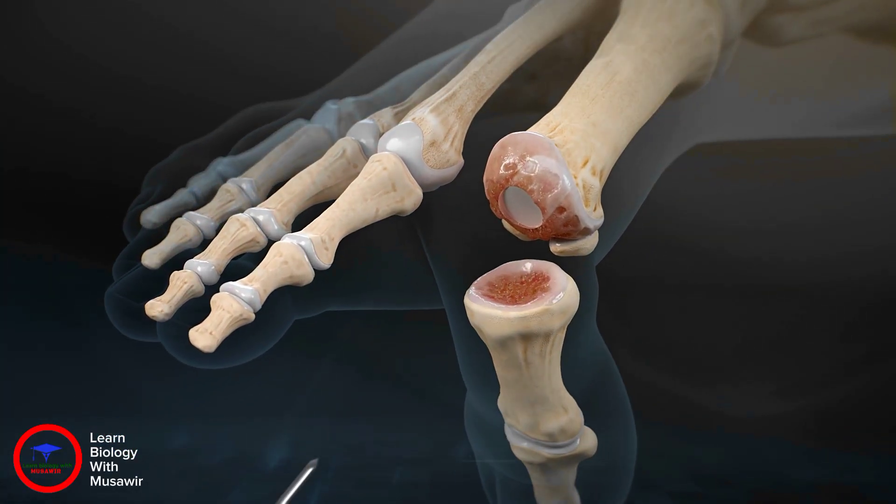Initially, a 1.6 millimeter guide wire is used to skewer the failed Cortiva implant and remove it from the metatarsal head.